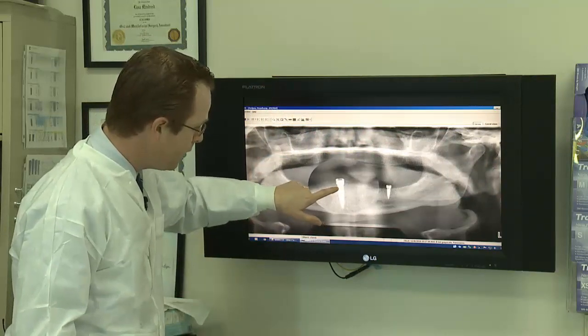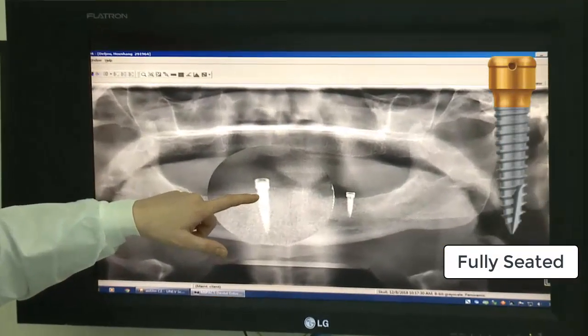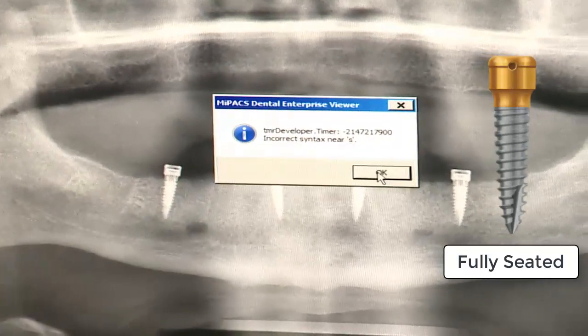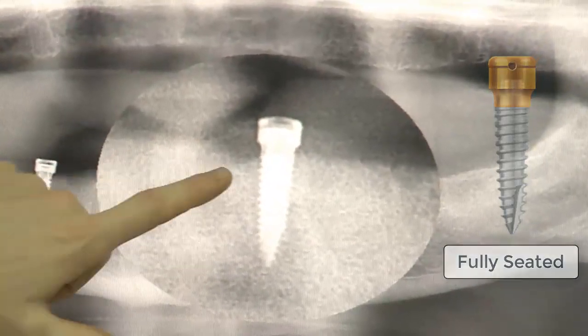Let's go to 27 first — this right here is a fully seated abutment. Go ahead and zoom in super close. You'll see we've got a fabulous seated abutment; everything here looks really good. 27 looks great. Now let's traverse over to 22 — you can see here 22 is also beautiful. Everything here looks really good.